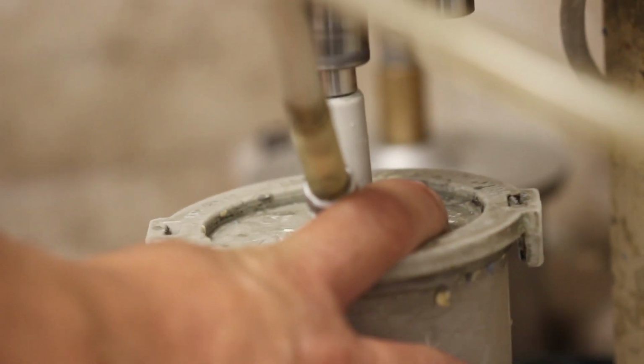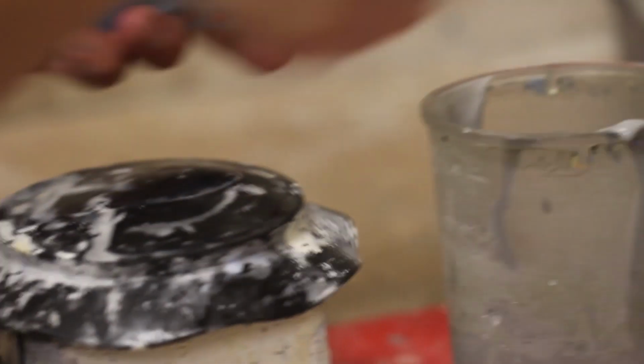Once the impression is made, you're going to want to take some type 4 gypsum and vacuum mix that, and you'll pour that into the impression so that you have a stone replica of what the mouth looks like. So you'll go around on a vibrator and make sure that the stone fills your impression.